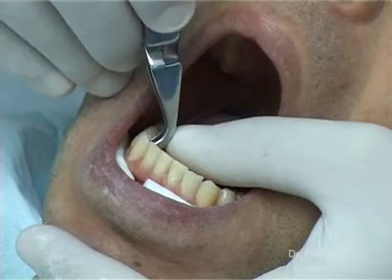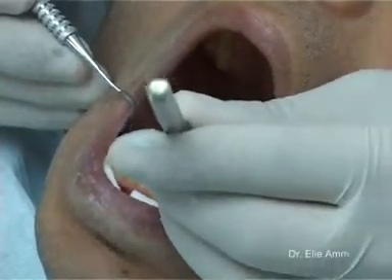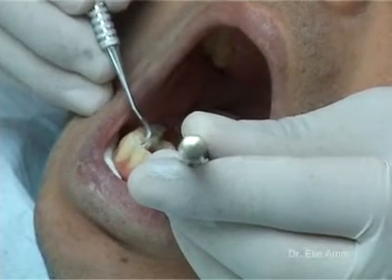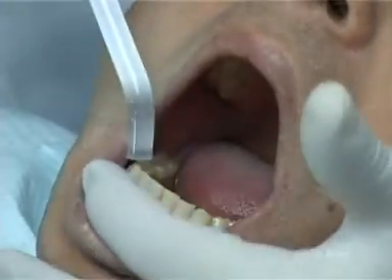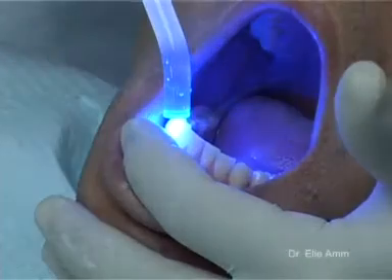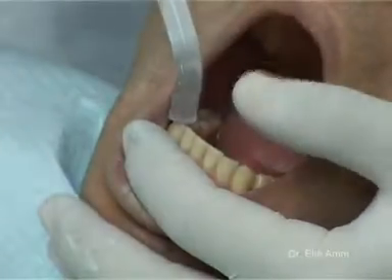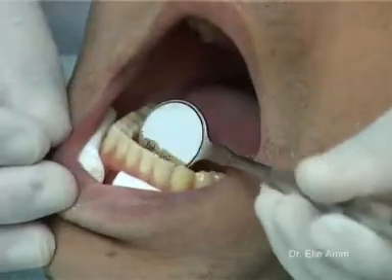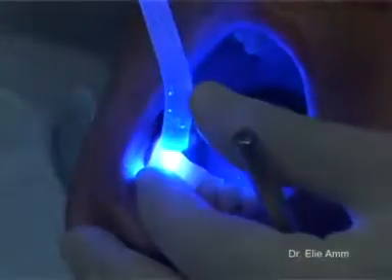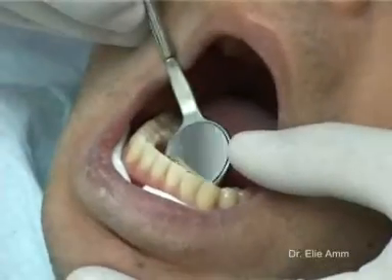With a small amount of composite resin in the mesh of the bracket, we bond the first bracket, adjusting its position with the scaler in an indirect view using a mirror. Light curing for 5 seconds, twice — occlusal and gingival — with a LED unit. The first bracket is now in place. The same procedure is repeated for the rest of the teeth.